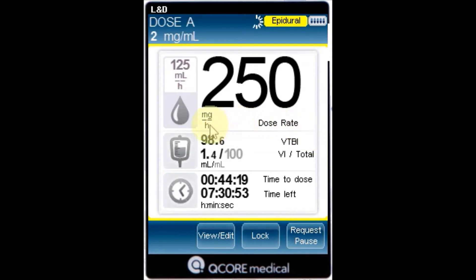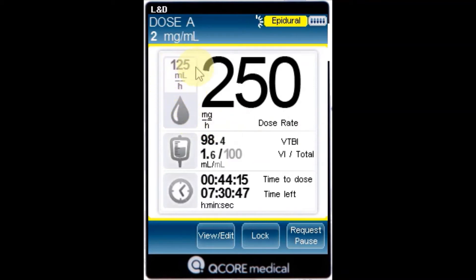Rate: the current infusion rate. For all dose units other than mLs per hour, the calculated rate will be displayed in mLs per hour both in the view system menu and in the running screen.